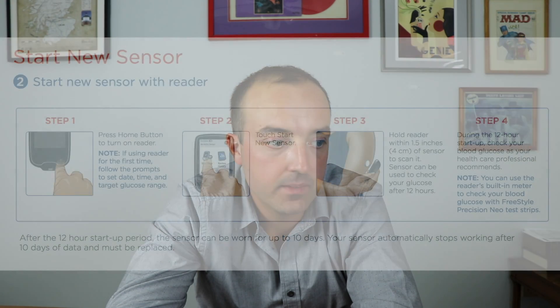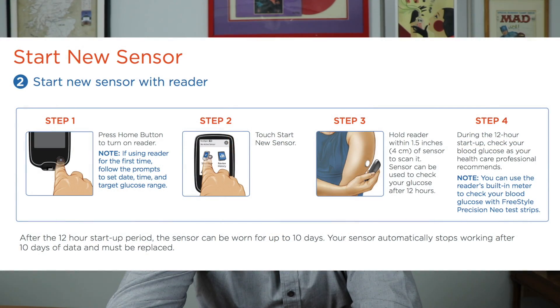There is a process to starting a new sensor. Press the home button to turn on the reader. There's a little icon that says 'start a new sensor.' Hold the reader within 1.5 inches of the sensor to scan it. The sensor needs about 12 hours to get going. During that 12-hour startup, you would do finger sticks as normal, and you can use Precision Neo test strips, which actually work with the reader that comes with the Freestyle Libre.